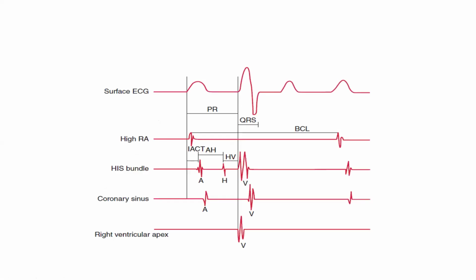So during EP, there are some important terminologies we use, which I previously described one. During EP, we have our surface ECG on the patient. You can use 12 lead, 3 leads. So basically, they usually use 3 leads, V1, lead 2, lead 3. We remember we said catheters are placed in different parts of the chamber, and it's only going to be testing that particular chamber.